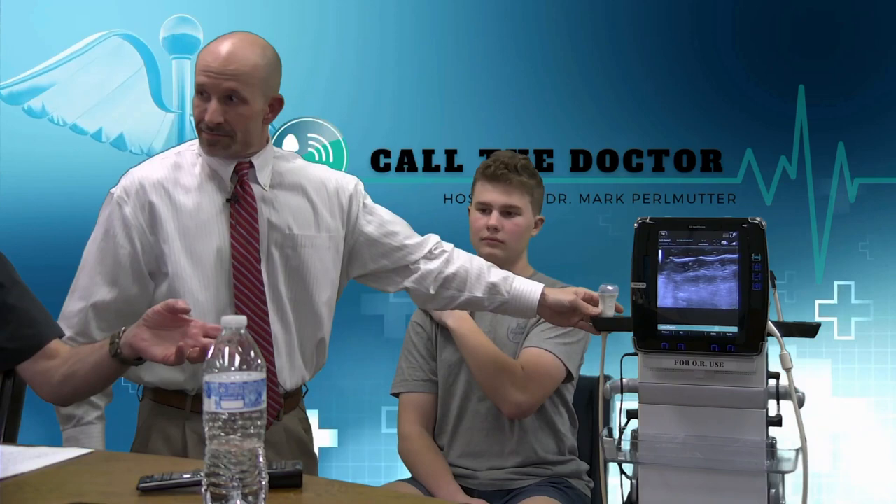To backtrack for a second: an ultrasound machine sends sound waves deep into the body, and on the monitor you'll actually see the reflection of those sound waves back into the transducer that you place on the skin. That gives you a black and white — sometimes color — image of the specific anatomy you're aiming the probe at. The sound waves go in, they bounce back, and the different densities of tissues have different frequencies bouncing back. That difference shows up in different shades of gray — dense structures appear bright, less dense structures appear dark.